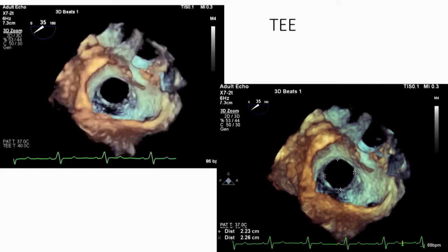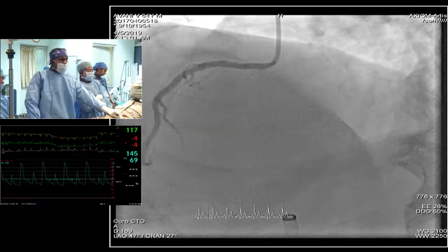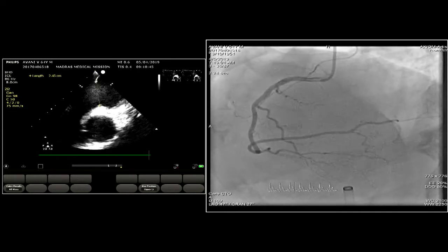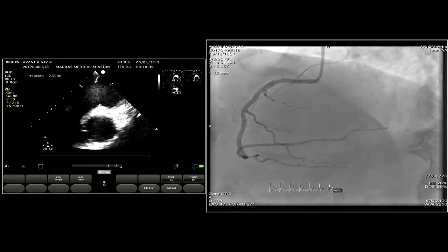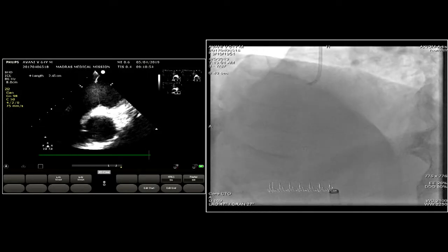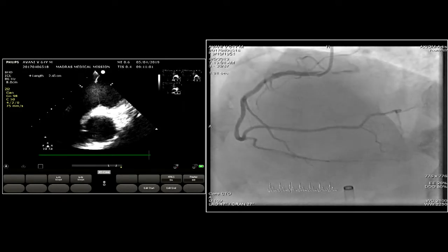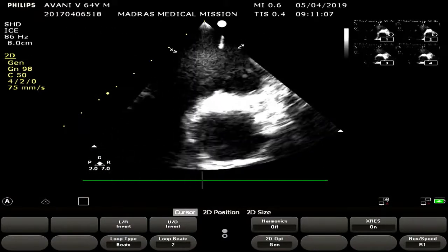Srija, can you measure? Now we are live in intracardiac. Can you switch over to echocardiography? Echocardiography live. So do you plan to go with this size, or do you plan to balloon and do the stop flow technique? No, we don't do balloon sizing. Right now on live, can you see the intracardiac echo? What you are seeing on the frame is the intracardiac echo, and now the measurement is something like 24, 25. Show it live, Srija.